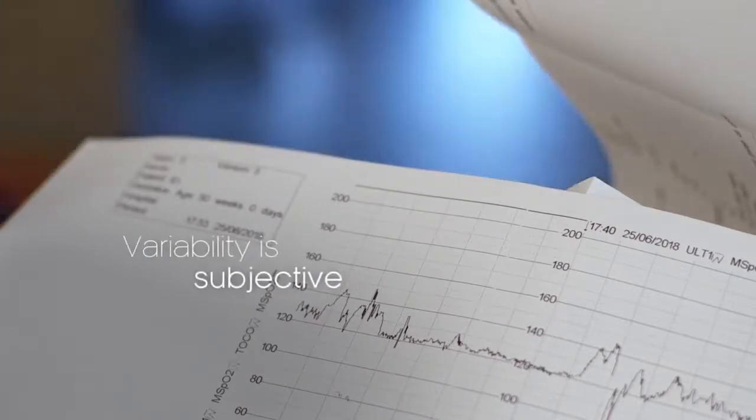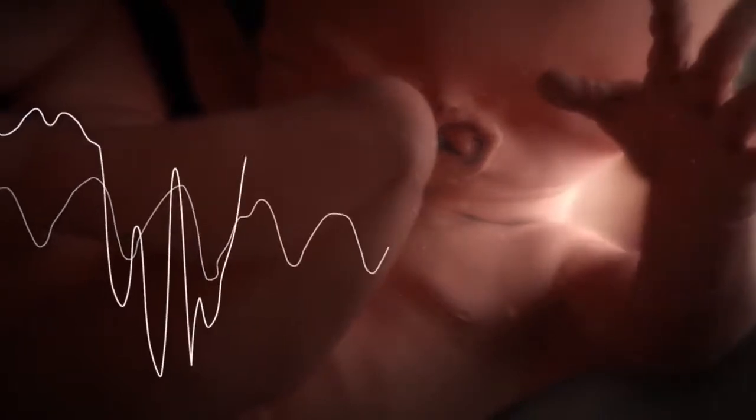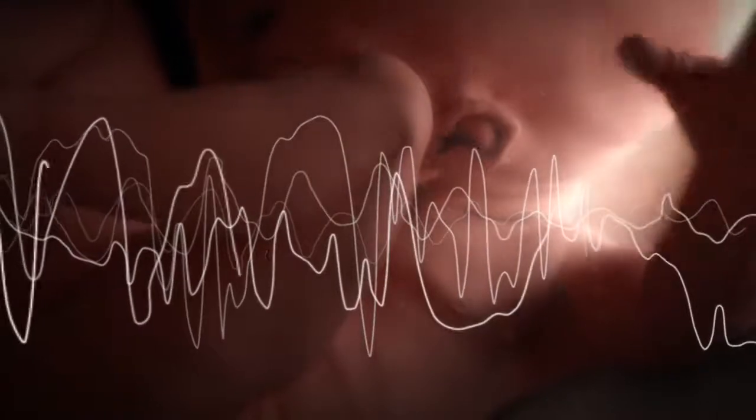Variability is quite subjective. There are some people that when the trace is quite flat, they say, okay, it's still normal, but it's not like that. I realized these were very complex patterns that we were looking at. It would be much better to computerize them.